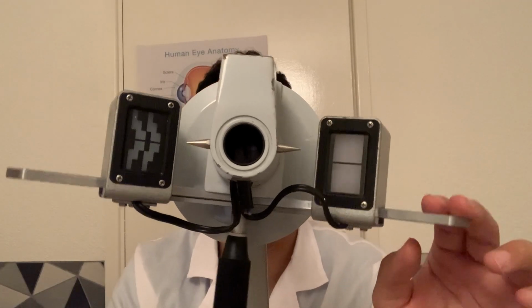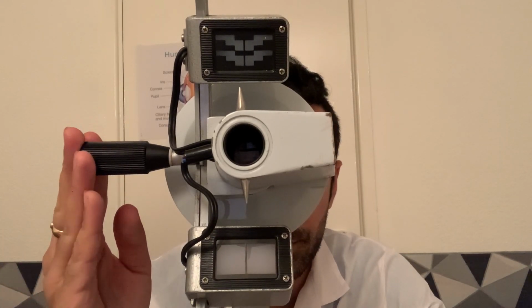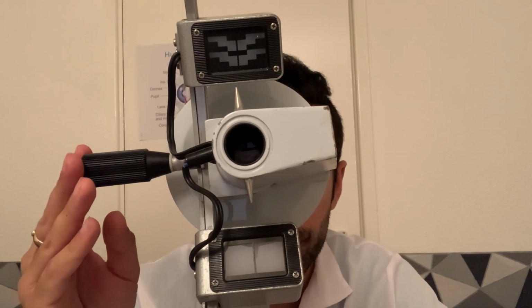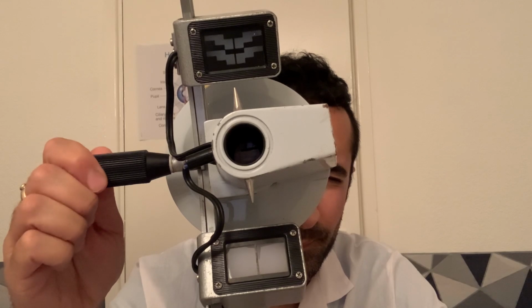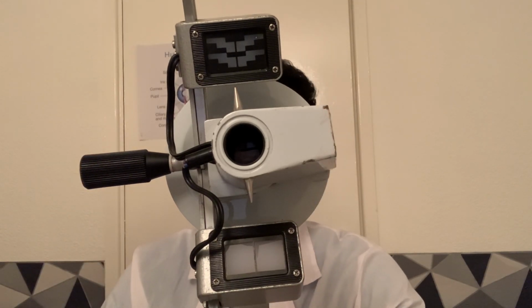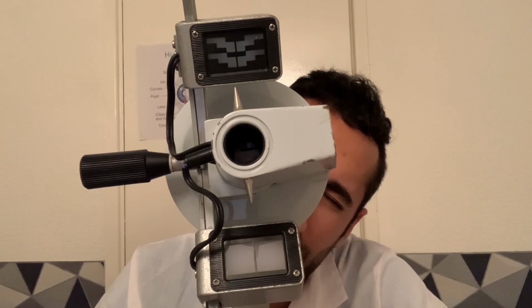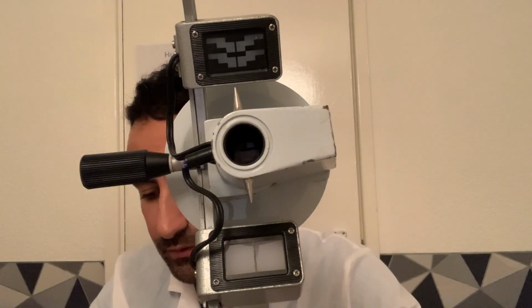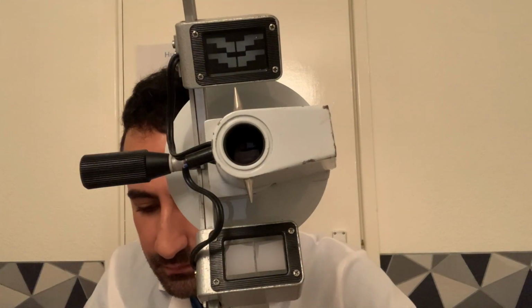Okay, so going directly 90 degrees to that, we'll hit 180. There we go, and just refine the axis now. Okay, so possibly 175 degrees. Okay, so we're looking at 175 degrees, and the curvature is 8.9 millimeters at 175 degrees. So that is your corneal curvature measured.